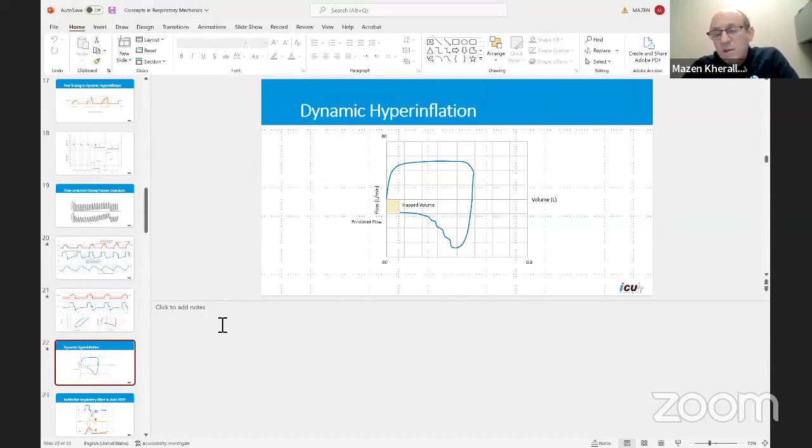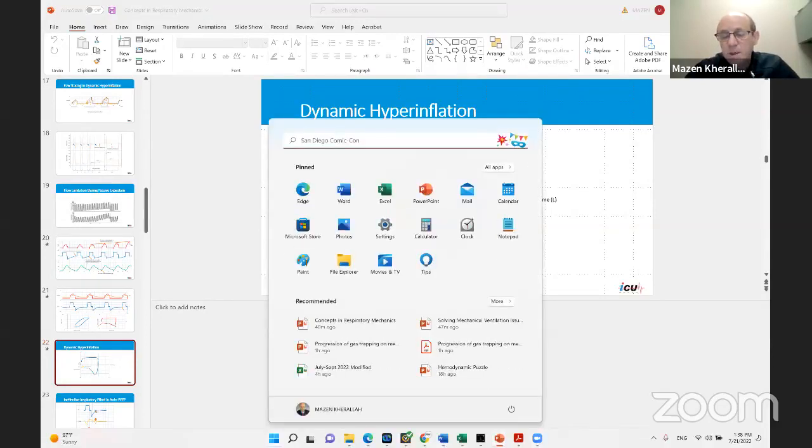We try to avoid using bicarbonate infusion as much as possible, but I don't want the pH to go below 7.15. So in severe cases, I'm okay with pH 7.16, above 7.15, and below that, I may have to start bicarbonate. Now, in terms of do we tolerate dynamic hyperinflation or not? Well, sometimes you may have to tolerate it, and it is really complex to understand what happens next if you do not resolve it completely. I'm trying to get the slides.